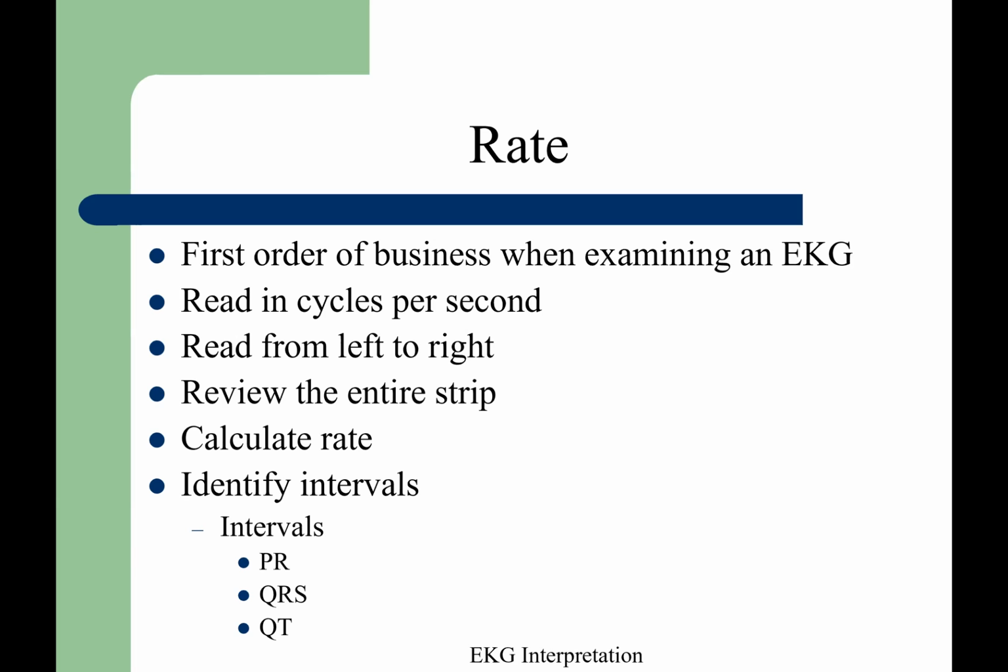Okay, folks, let's talk about chapter 4 in Dale Dubin's book. Now we're going to talk about calculating the rate. How are we going to start to do this? This is going to be the first thing that we want to start thinking about. When we're examining these EKGs, it's definitely going to be important because it's going to determine what rhythms we might be selecting, specifically for our sinus rhythms.